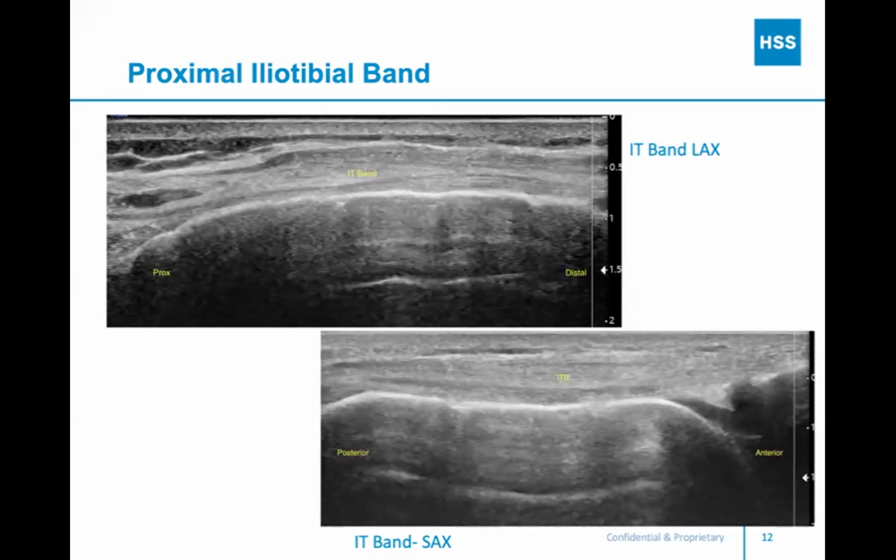And also, with the IT band, there's multiple areas of pathology, right? Some of them are at that lateral femoral epicondyle, and some of them are insertional tendinopathy at Gerdy's, which we see more commonly in arthroplasty folks, which doesn't really apply to this patient. So I'll start with people in that supine position and look at those structures in the lateral retinaculum and how that attaches to the lateral structures. Then I'll flip them sideline like you do.